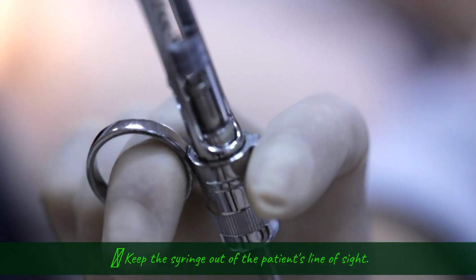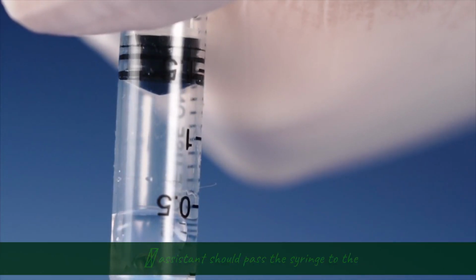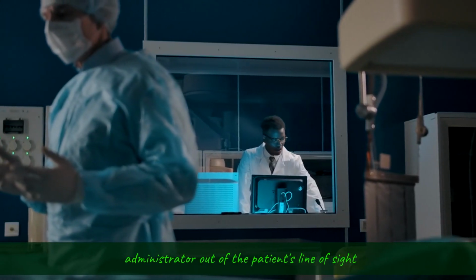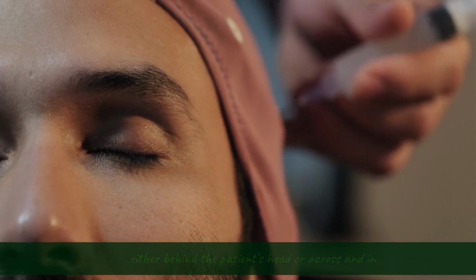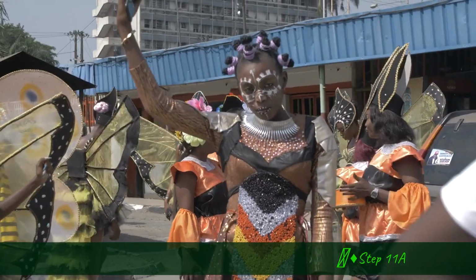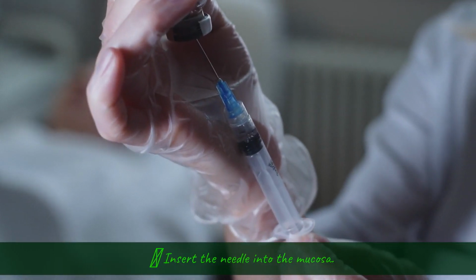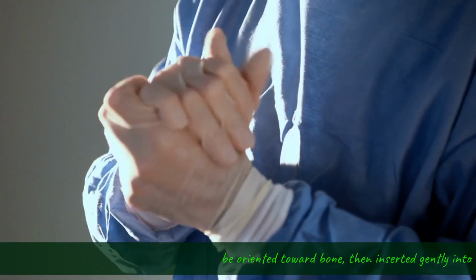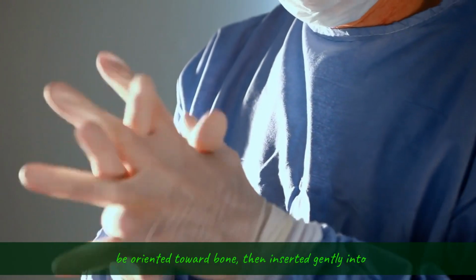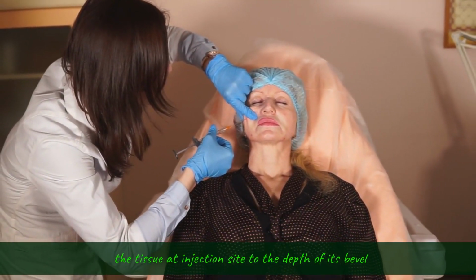Diamond, Step 10. Keep the syringe out of the patient's line of sight. The assistant should pass the syringe to the administrator out of the patient's line of sight, either behind the patient's head or across and in front of the patient. Diamond, Step 11a. Insert the needle into the mucosa. As a general rule, the bevel of the needle should be oriented toward bone, then inserted gently into the tissue at the injection site to the depth of its bevel.